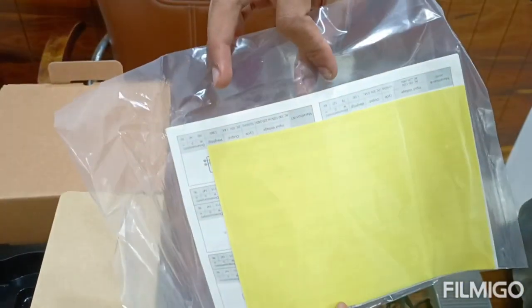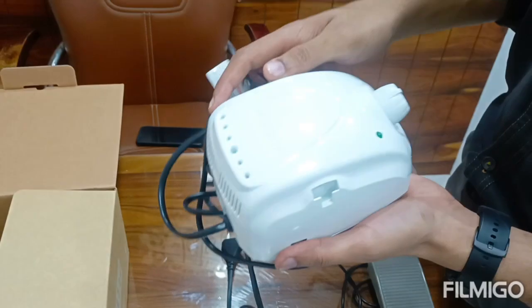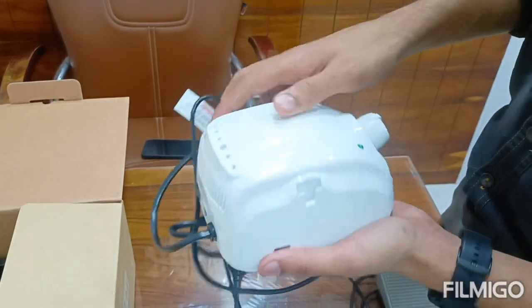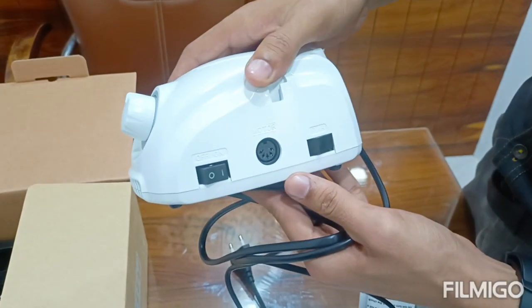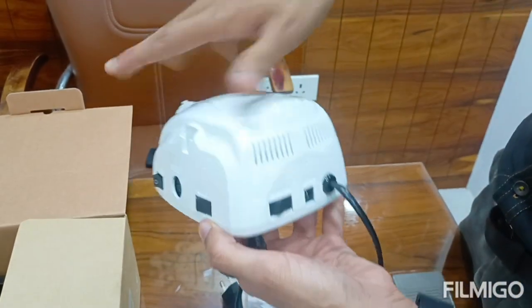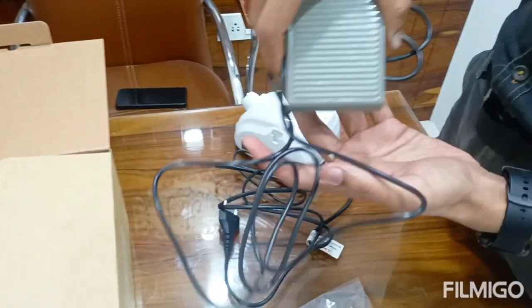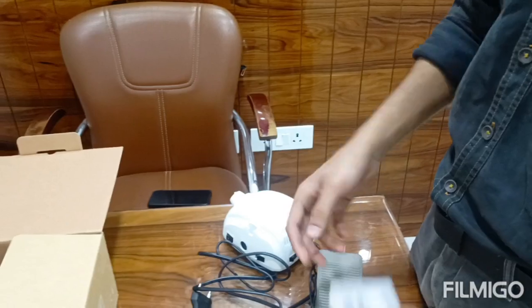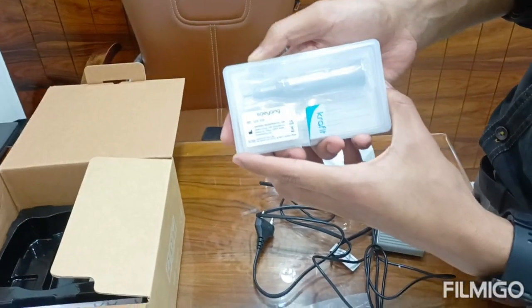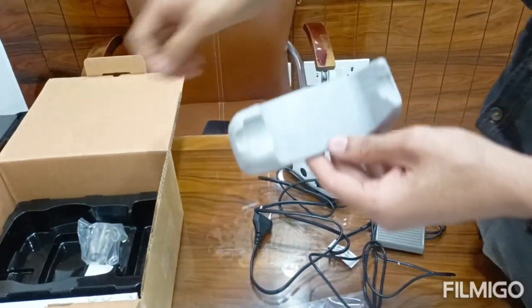User's manual. Micro Marathon Motor. The accessories included are: foot pedal, hand piece, and two stands.